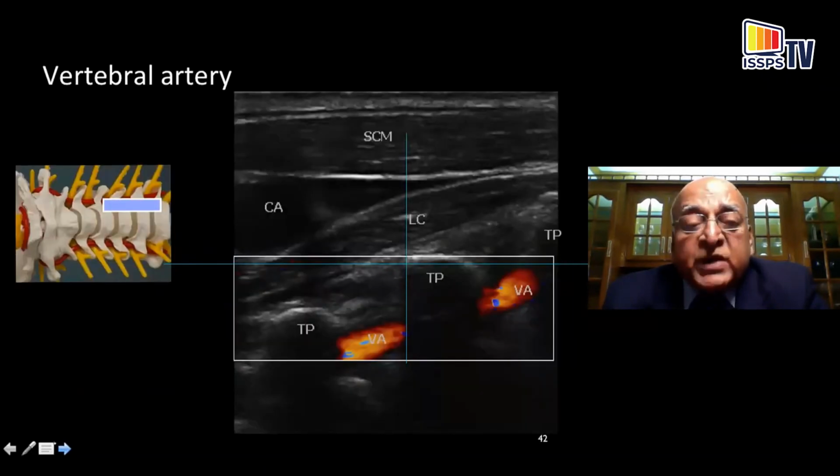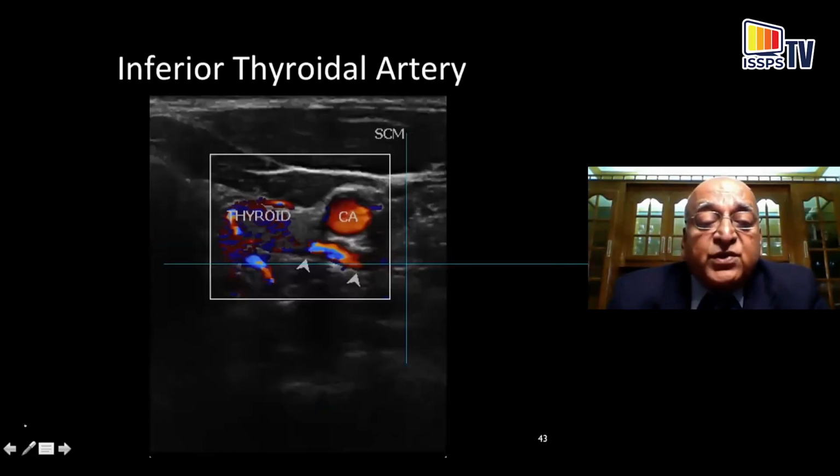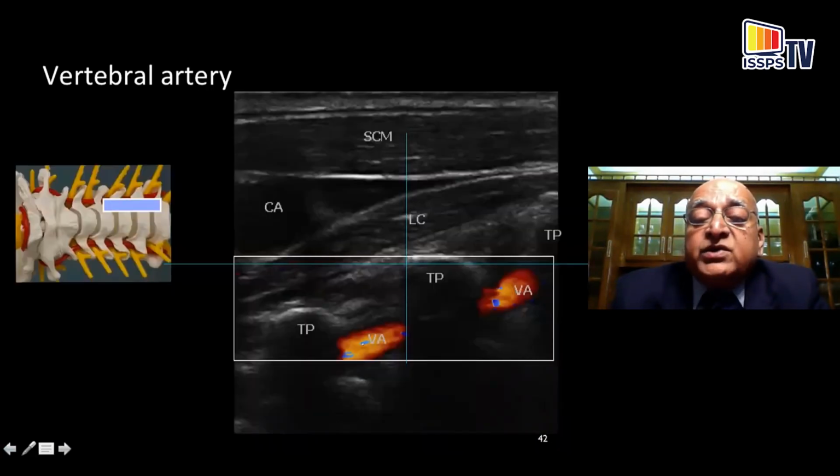As always, you want to make sure that besides the carotid artery, there is the vertebral artery, which can cause major issues if you inject intravascularly. And that is usually identified by using the color Doppler. They do not show up because of the bone here in the transverse process, but just outside of the transverse processes, you can locate them by using the color Doppler.